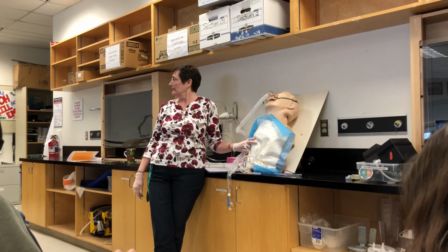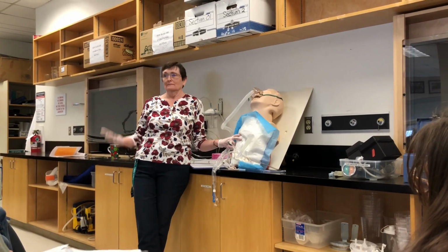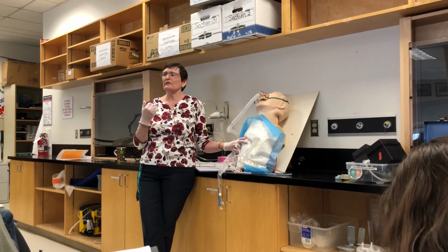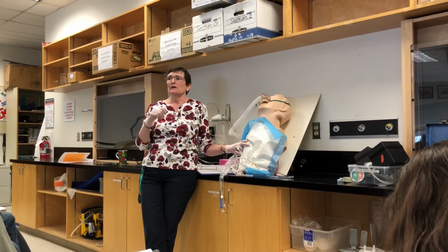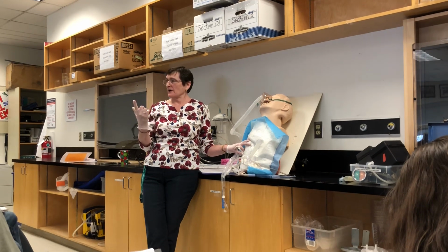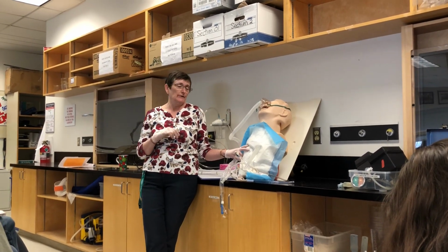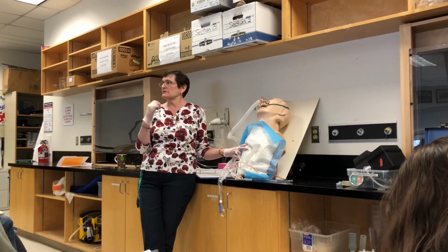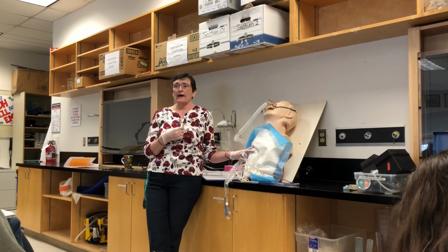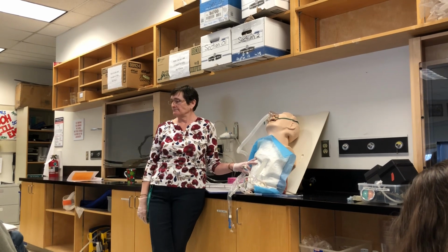Why do I want to hear him talk? Like a muffled voice or something like that. You bet. I'm looking for muffling of his voice. He will sound a little croaky, that's okay, but the muffling part will tell me we've got an upper airway obstruction. Does he have stridor? These are the kind of things you're keeping an eye out for. If you're seeing signs of stridor, then this would be the opportunity to give him the nebulized epinephrine that you have, and also some Decadron or dexamethasone IV.